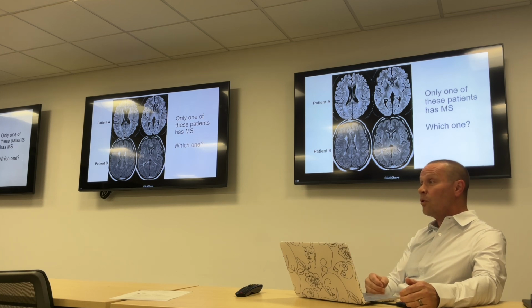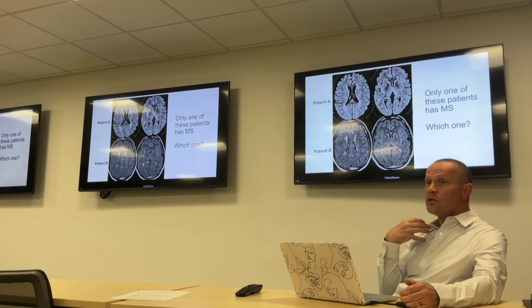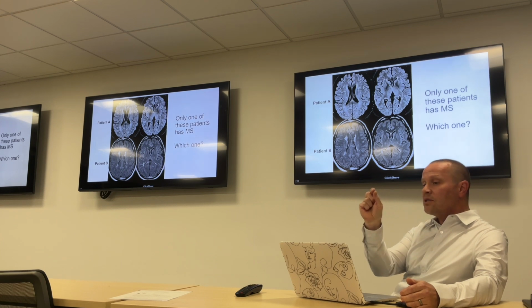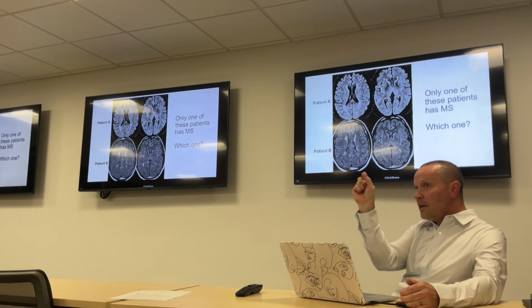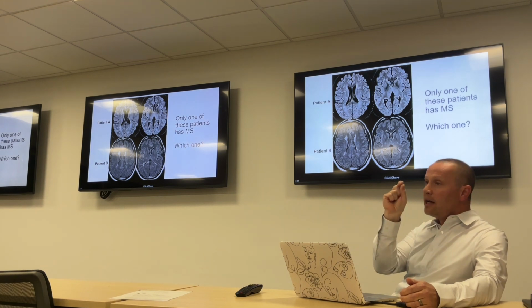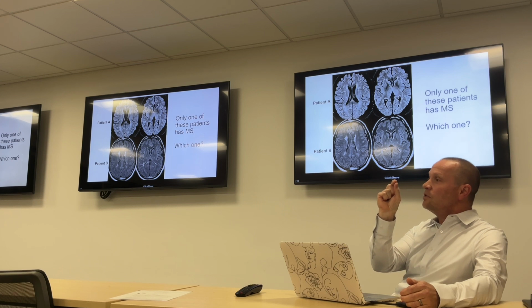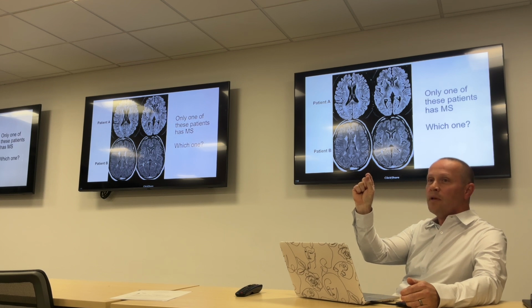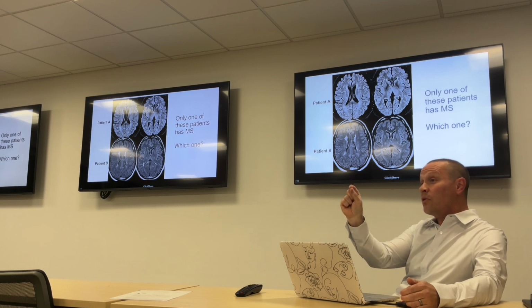So if you see on your report small vessel disease or chronic microvascular disease, those are the words that we use to explain a phenomenon that nobody really understands. It's that as we get older, the brain doesn't look quite as clean on MRI. There are little dots that start showing up. The hypothesis is that it's probably due to tiny little blood vessels that sort of don't quite make it. And although they're supplying that part of the brain most of your life, at some point they kind of shrivel up, don't quite make it, the blood doesn't get there, and that little part of the brain dies.